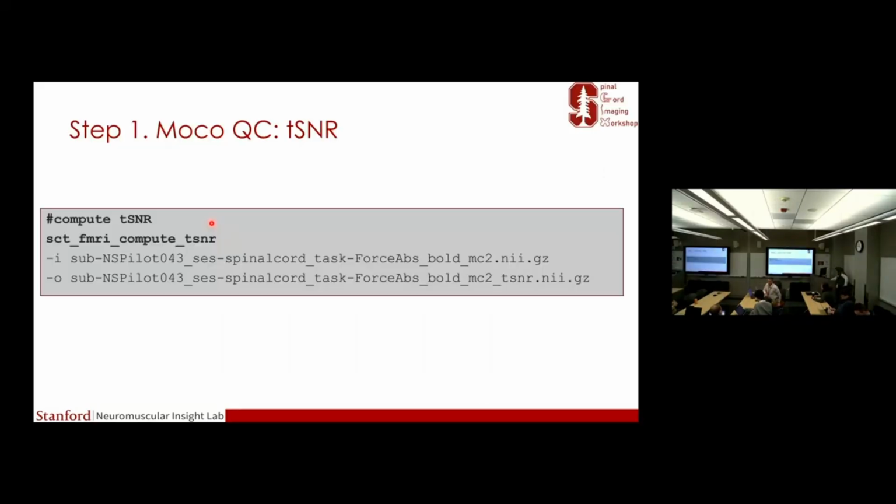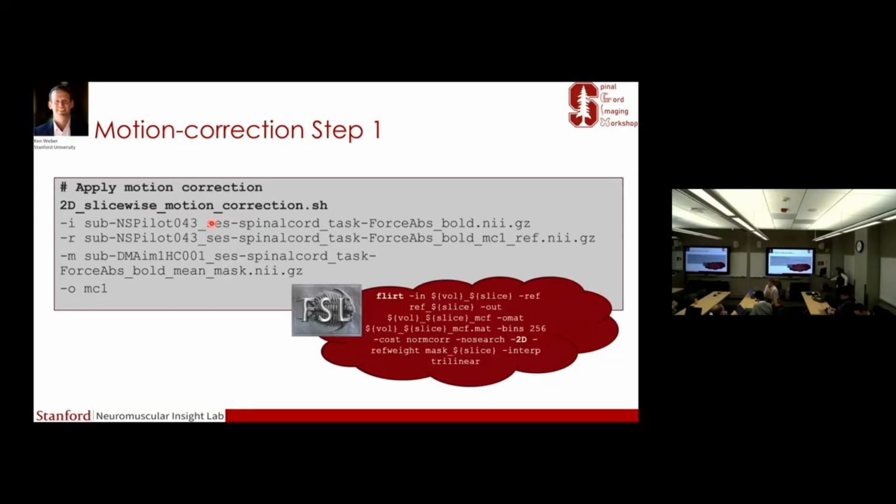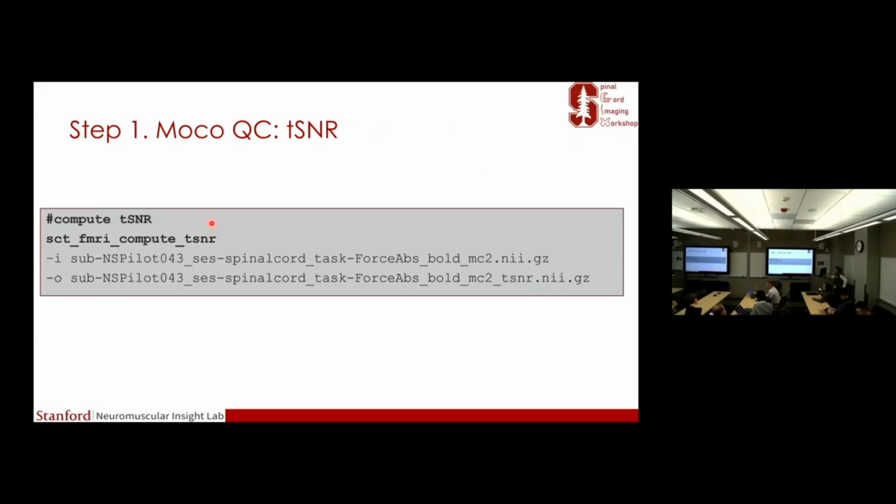Because speaking of harmonization and comparing protocols, if people compare TSNR but it is not computed in the same way, that's not very helpful. Today we've seen SNR ranging from 10 to 50 or something. Yeah, we want to be able to look within the cord. I think motion correction seems like a necessary step, because the raw time series is not going to be as helpful. But you haven't been reviewer number 2 and said recompute everything, your TSNR.